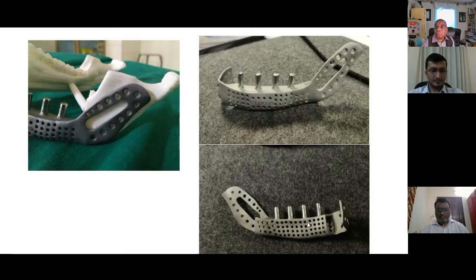After 4 to 6 months, CBCT revealed that the entire hollow component of the prosthesis is filled up with an endosteal to endosteal continuum of new bone. Whenever I probed with a sharp probe into this porosity, I encountered some resistance, a bony hardness.